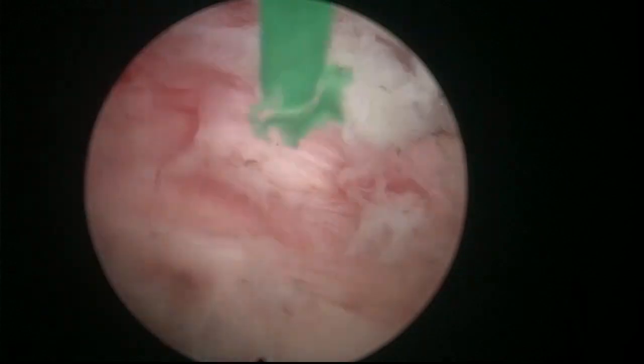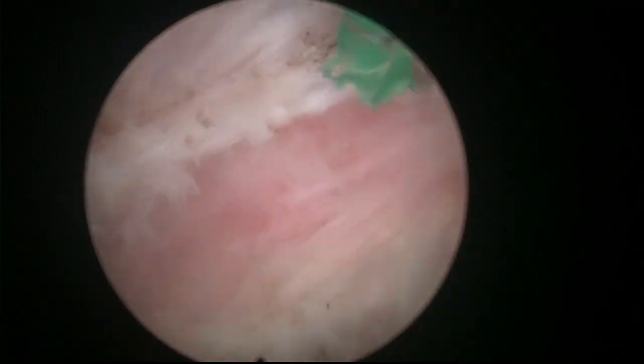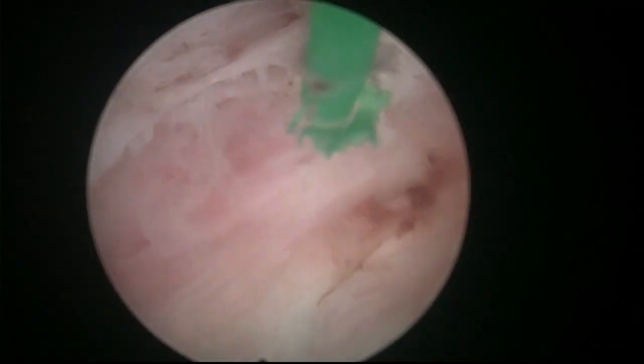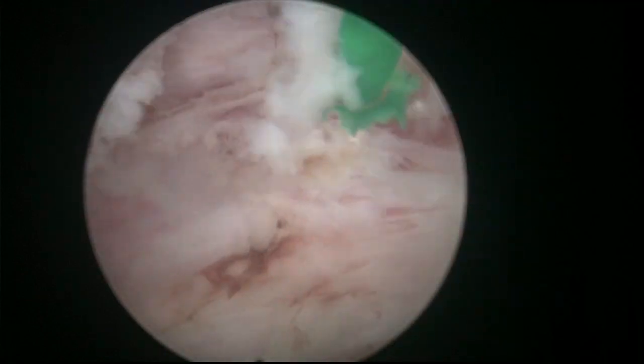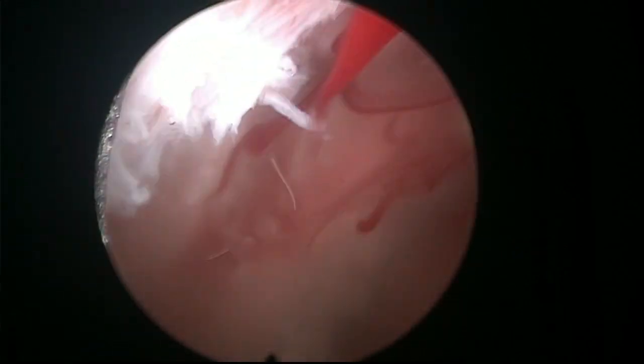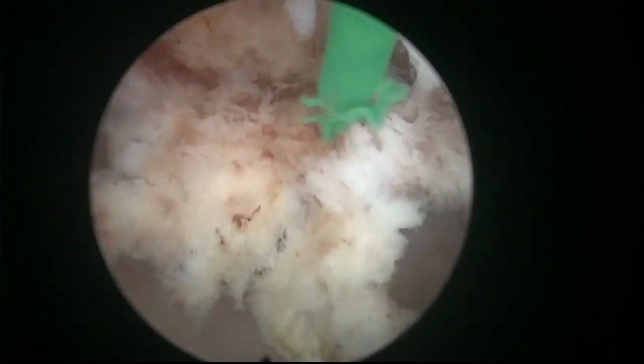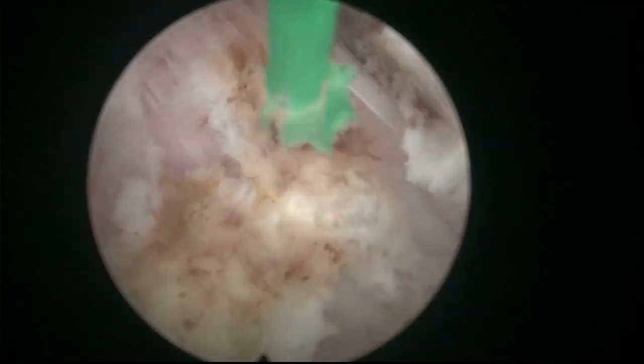Here I'm using, let's say, the full power. Of course, the tissue effect depends not only on the power, but also on the working distance. So you can tailor the effect you want. So my feeling is I'm going a little bit faster. Here, for example, I will use the coagulation as I'm much closer to the anterior sphincter. It's another small bleeder. There we are. That will fall off on its own, or I will trim it just to let it go.